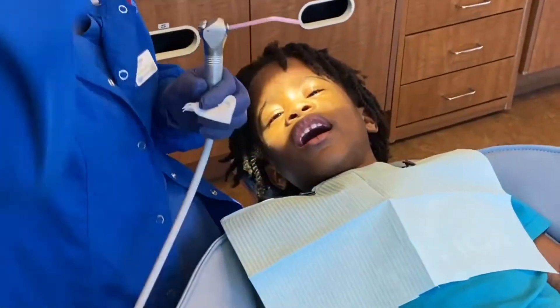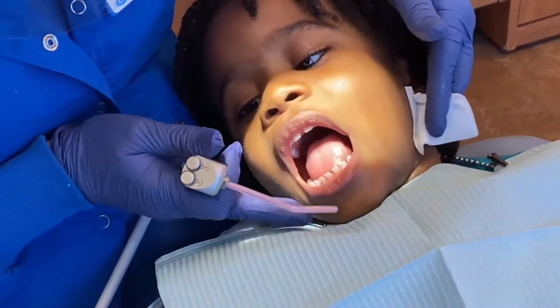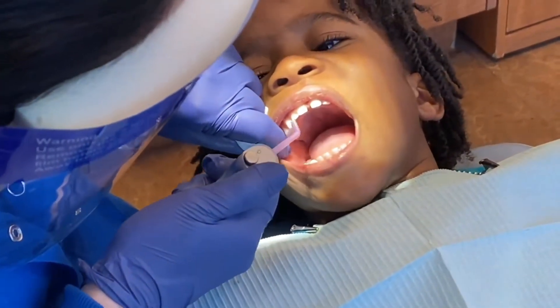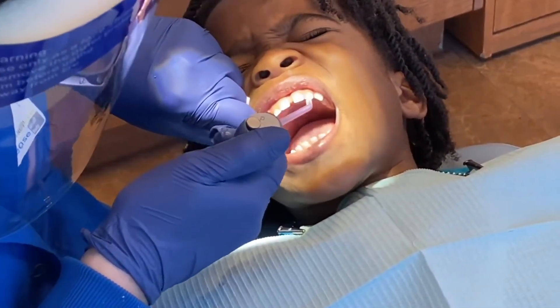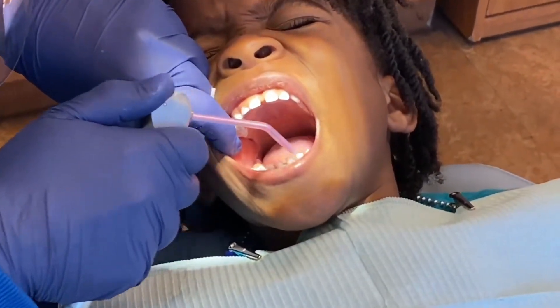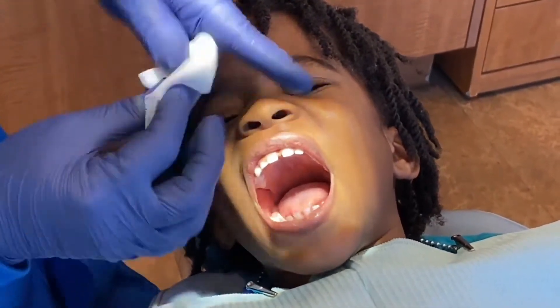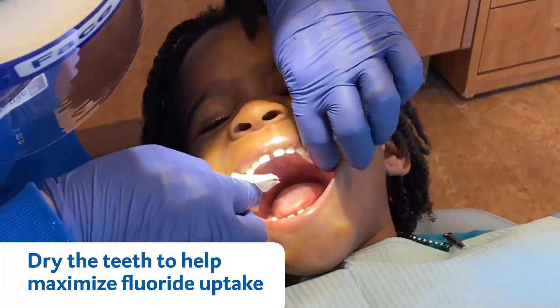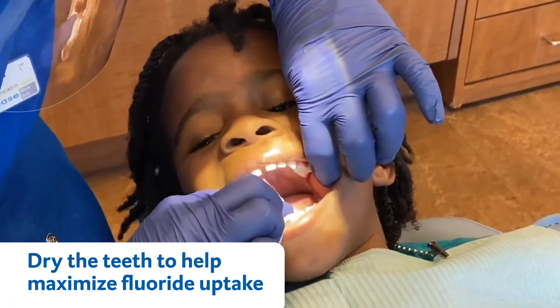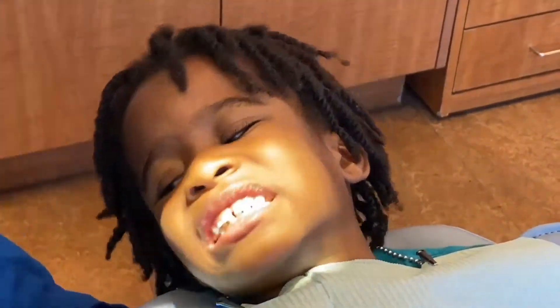We have to blow some air to make them nice and dry. Look at those nice shiny teeth — perfect. We're gonna use a little gauze and dry those teeth so the fluoride varnish will adhere nicely, maximizing the uptake of fluoride.